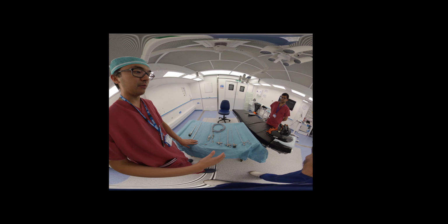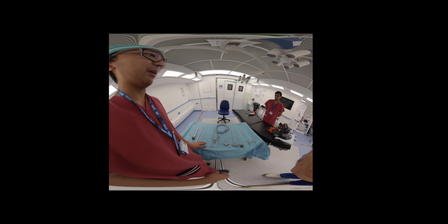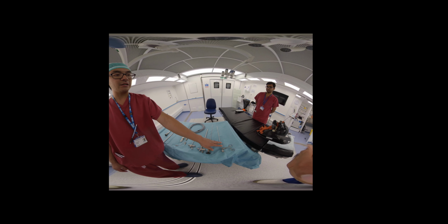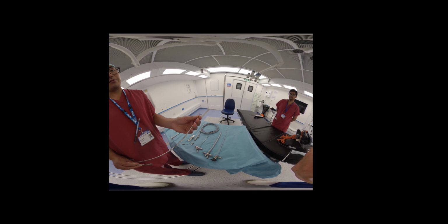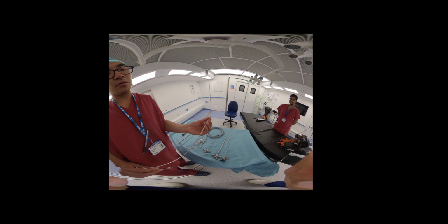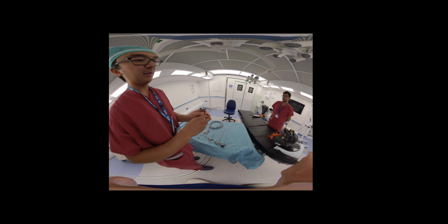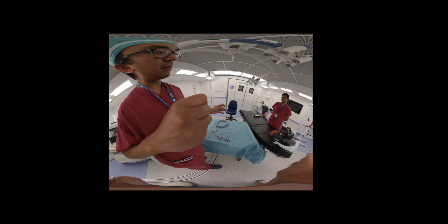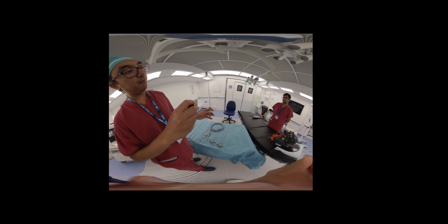The other equipment that you'll need, for example, if you're doing this in an emergency, is removing a coin or a foreign body that a child has inhaled, or a peanut, for example. You need some optical grasping forceps. The reason they're called optical grasping forceps is that they can grab different types of foreign bodies, and you have ones for peanut and ones for coins, and essentially foreign body specific grasping forceps. And the optical is because you can put the 0-degree Hopkins rod in through them, and when you insert it with a light lead adapter facing upwards.